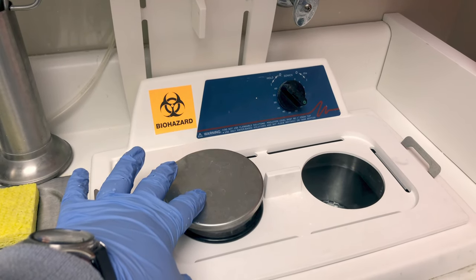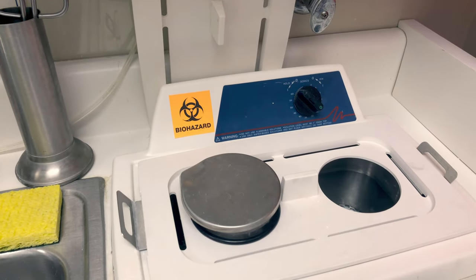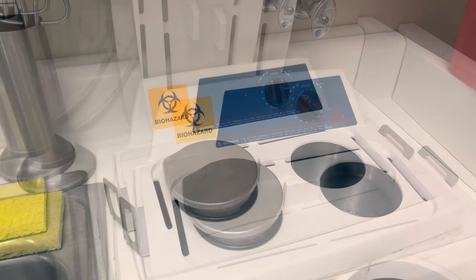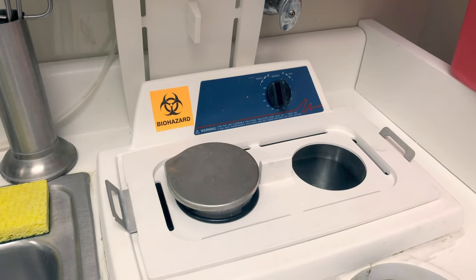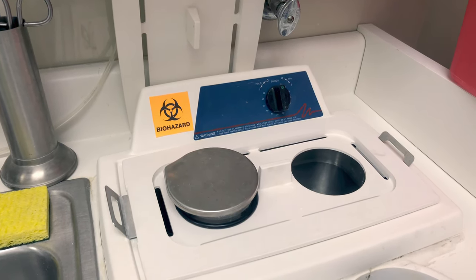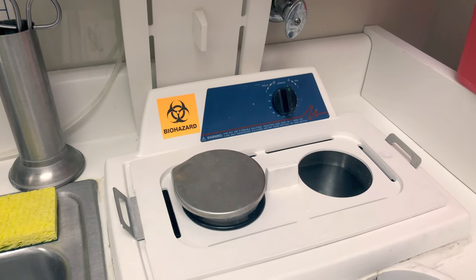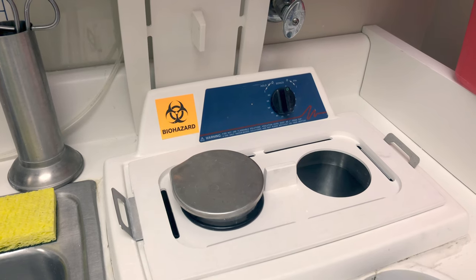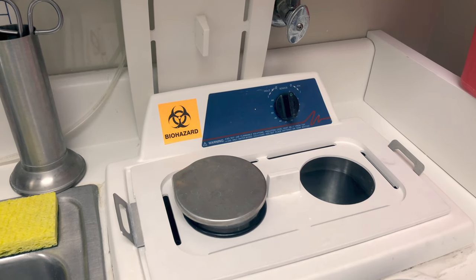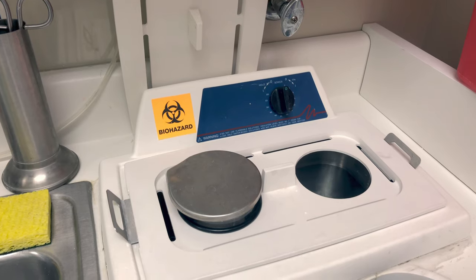A special side note about ultrasonic cleaners: we don't want to use ultrasonic cleaners if someone in the office has a pacemaker. The ultrasonic frequency — the sound waves — can affect the pacemaker. Really anything that runs on electricity can affect pacemakers: microwaves, speakers, cell phones. But we're especially concerned about ultrasonic cleaners and ultrasonic scalers, so make a note to not use these devices if someone is in your office with a pacemaker.